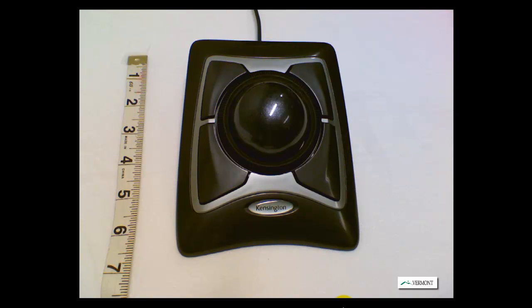We could also assign drag lock to this particular button area. Drag lock will allow for highlighting of text within a word processor, or maybe moving or arranging icons on the person's computer desktop. Drag lock is extremely helpful for people who have difficulty gripping or grasping the mouse, holding the single click button down and at the same time moving the mouse in order to highlight text and/or move and arrange objects on the computer screen.